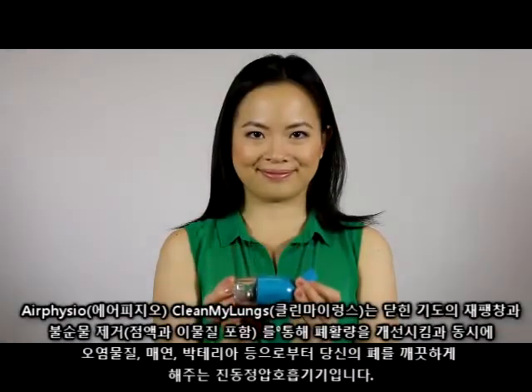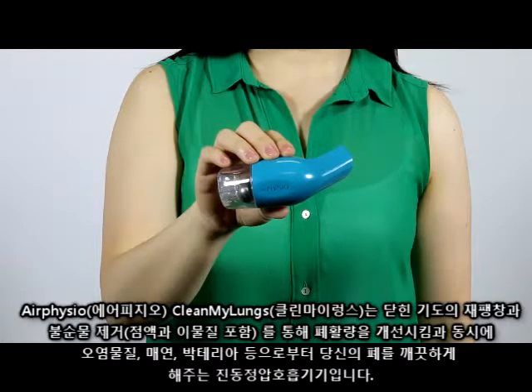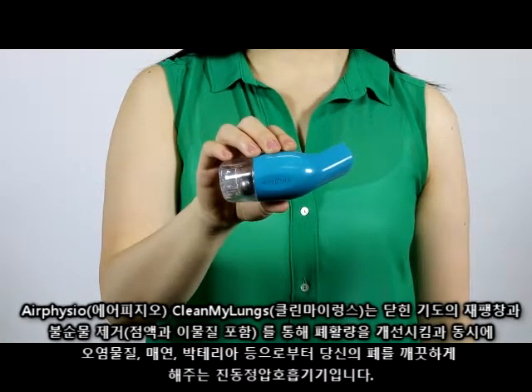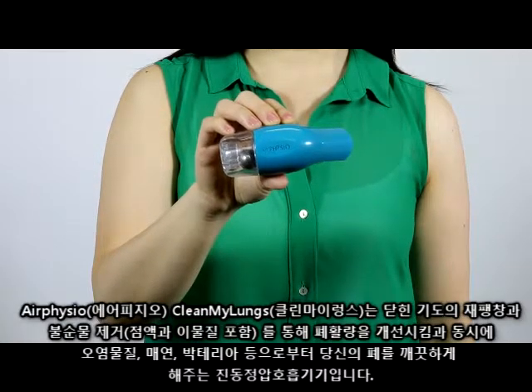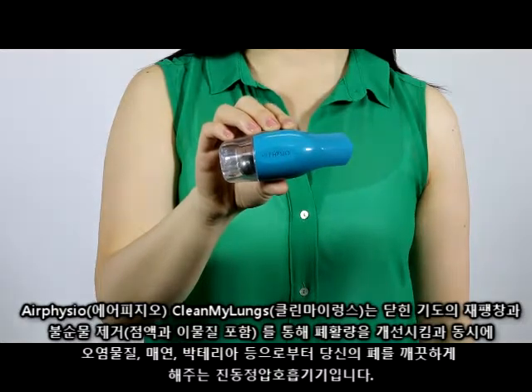Air Physio Clean My Lungs is an oscillating positive expiratory pressure device used to help you clean your lungs from pollution, smoke and bacteria, while helping you increase your lung capacity through reinflation of closed airways and removal of blockages, including mucus plugs and foreign objects.